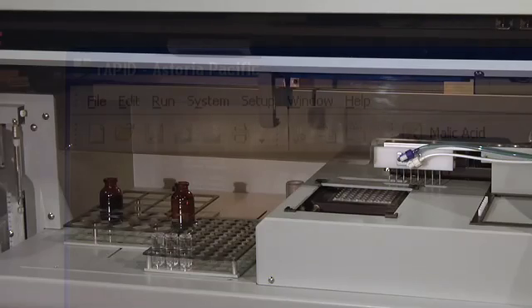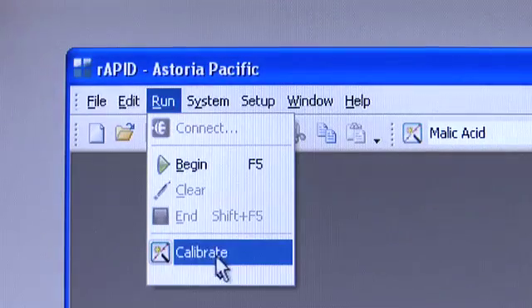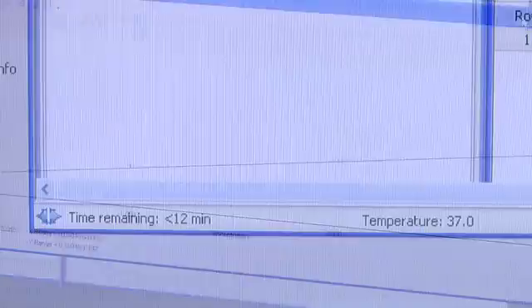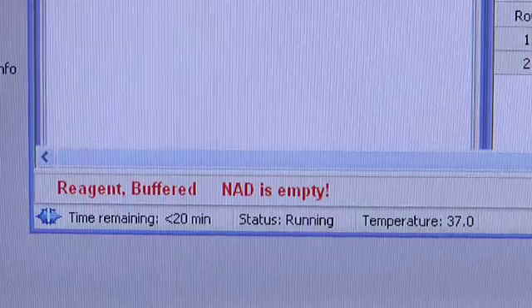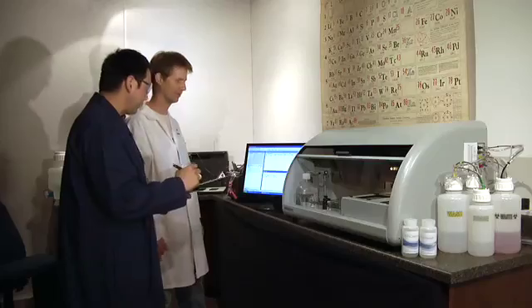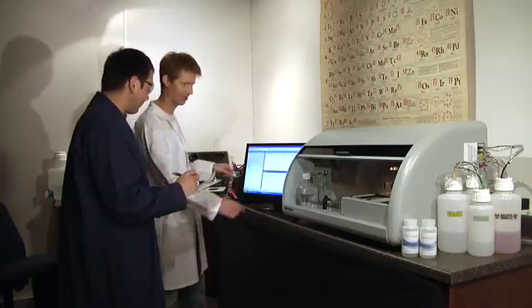During operation, the Astoria discrete can prepare calibration standards from a stock standard, dilute out-of-range samples, and detect low levels of reagents or samples. These automated procedures make the system easy to use and maintain, which also means less time spent training lab personnel.